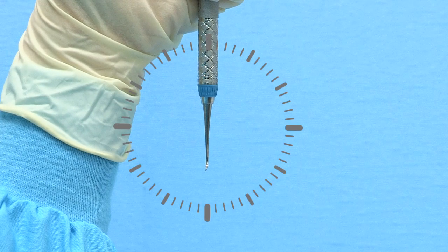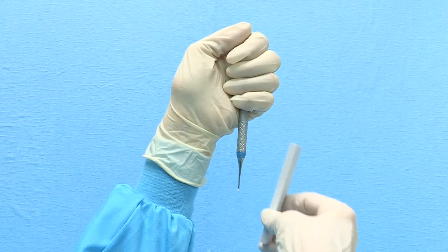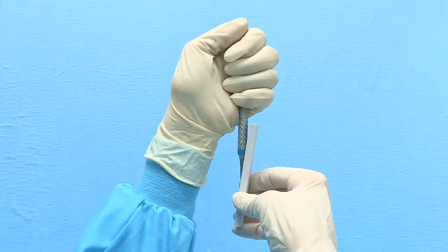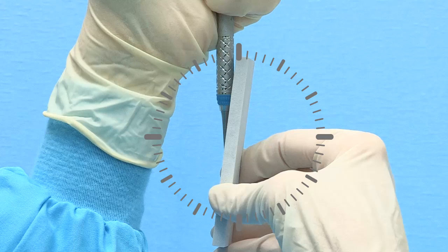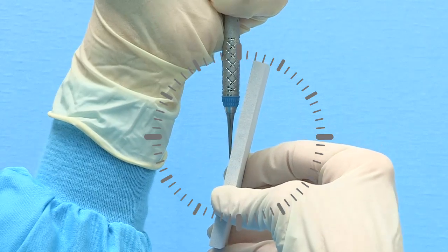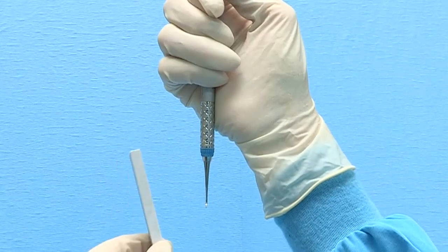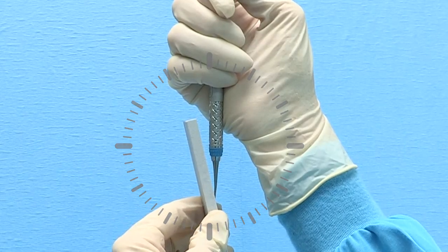Using the clock as a guide, hold the instrument vertically with the lower terminal shank positioned at 12 o'clock. The tip of the instrument should be pointed toward you. Place the lubricated side of the stone against the right lateral surface of the blade. Right-handed clinicians should initially place the stone at 12 o'clock and then tilt the top of the stone slightly away from the handle to approximately 3 minutes past 12 o'clock. Left-handed clinicians will tilt the stone to approximately 3 minutes before 12 o'clock.